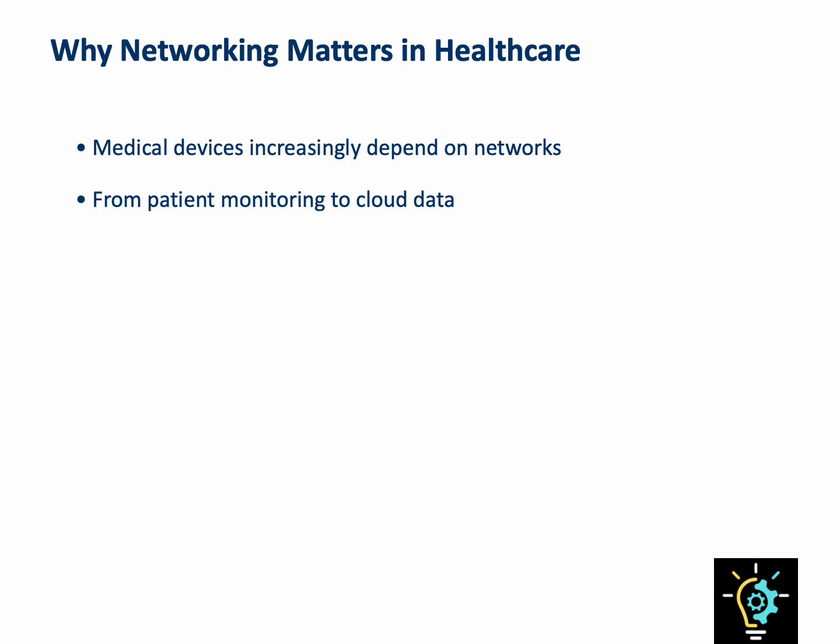Why does networking matter in healthcare? To answer that, let's look at how hospitals function today. Every modern hospital is essentially a networked environment. The infusion pumps, ventilators, and monitoring equipment are all not designed to work alone. They're all linked into systems that allow the data to flow between staff, departments, and even cities.